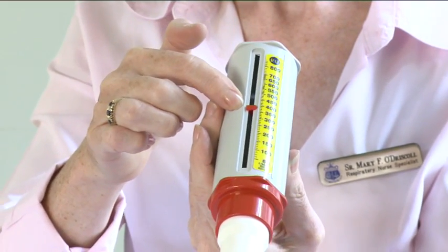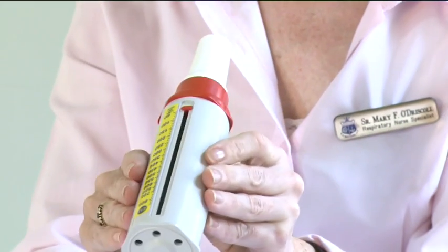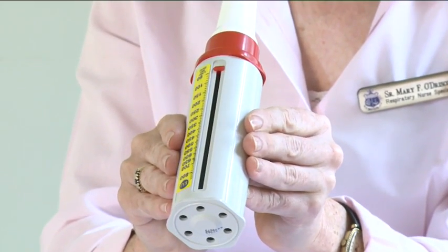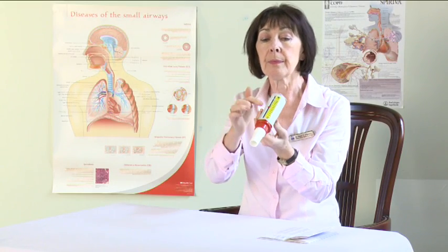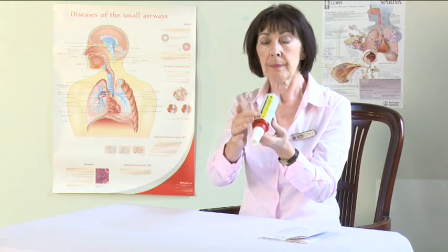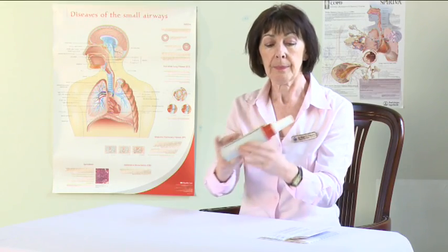Note the number on the scale indicated by the pointer. Return the pointer to zero and repeat the procedure twice more to obtain three readings. Mark the highest of the three readings on your peak flow diary.